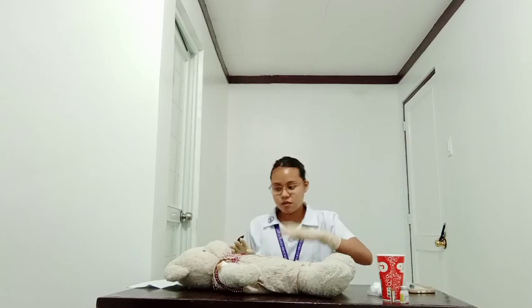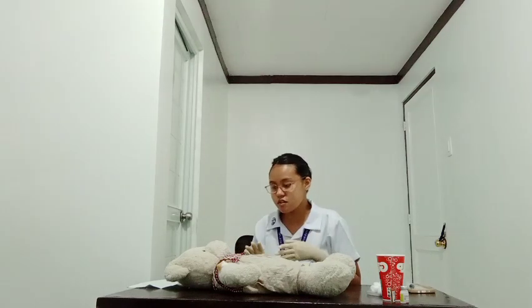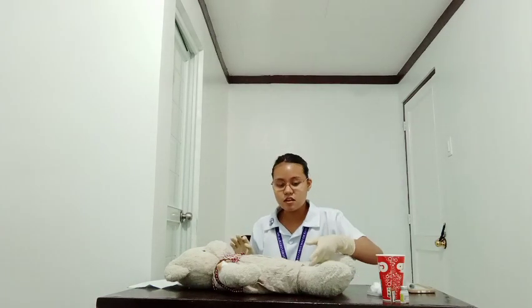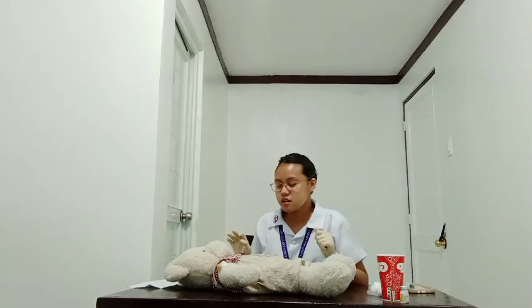So now we need to prepare the client. Prior to performing the procedure, introduce self and verify the client's identity using agency protocol to enhance rapport and ensure that care is being rendered to the correct patient. So good day, ma'am. My name is Isaiah Michael J. Velasquez, your nurse for today. We will be conducting a subcutaneous injection. Later I will be injecting in your upper thigh right here.